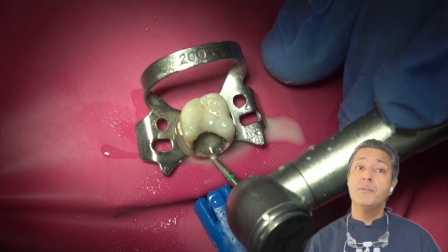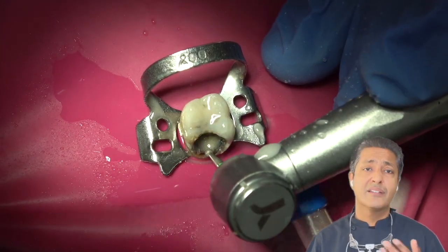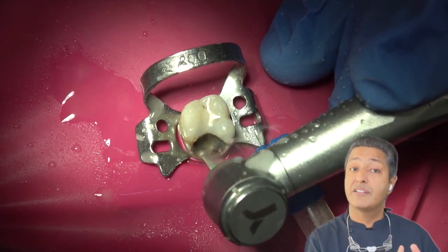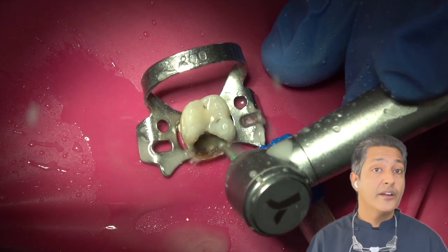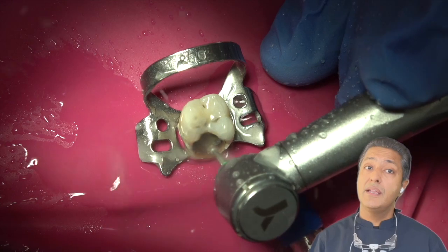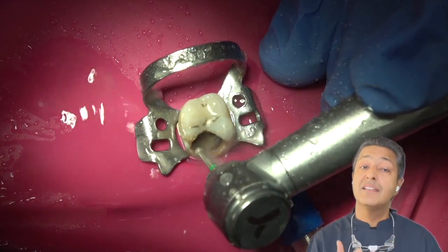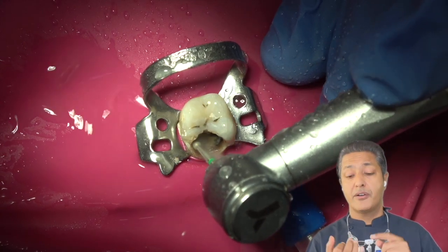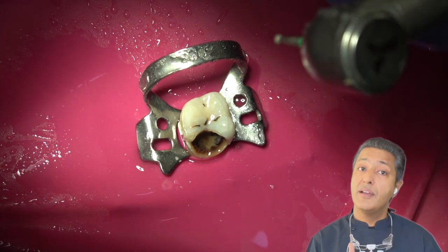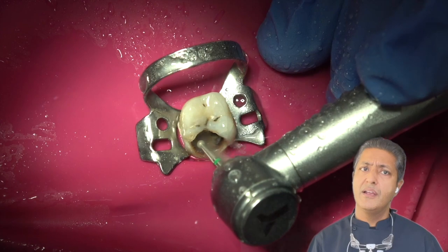When we are doing peripheral excavation, we generally use a round burr to excavate the enamel and the superficial part of dentine in this phase. What we are trying to do is give a sound periphery to the central part. At the same time, we are gaining access towards the central part. We are removing the caries lesion from the peripheral part, and all the unsupported tooth structure which is of no use or has become carious.